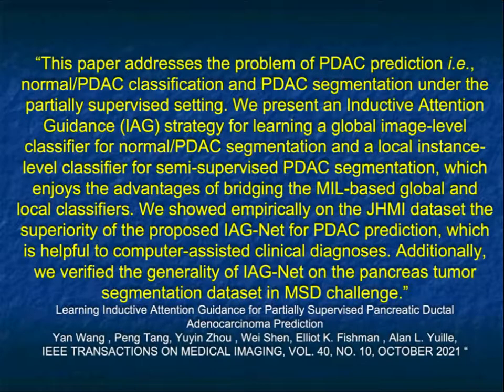this inductive attention guidance strategy for learning a global image level classifier, and a local instance level classifier for semi-supervised pancreatic adenocarcinoma segmentation will have certain specific advantages.